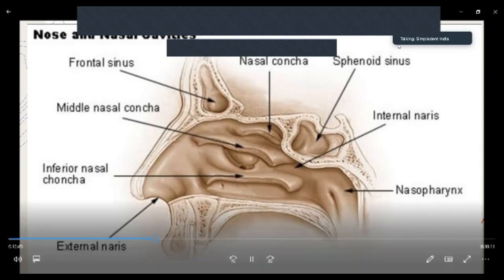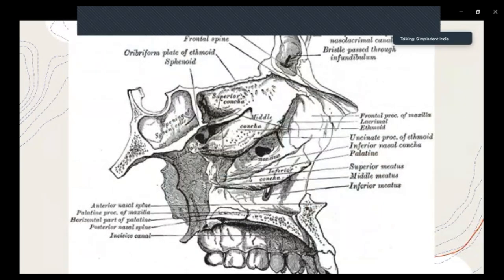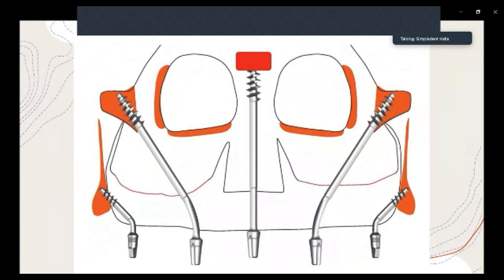There's a particular point where the glabella implant has to be engaged to have a good insertion torque and a better prognosis. This is the point where the nasion is, or where the fusion of the floor of the frontal sinus and the nasal bone is. That is the point where we have to engage the implant. Otherwise, the stability won't be there. So these are some of the pictures, but that is an idea of how we should be doing the implants.